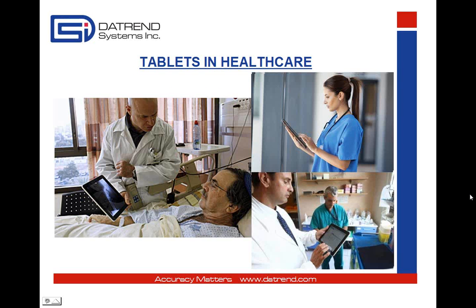Okay, well, let's leave behind the technology of the 90s, and we're going to jump ahead to now. Over the last few years, the use of wireless technology and inexpensive mobile computing devices, and in particular tablets, has expanded greatly in the hospital. There's an obvious benefit to medical imaging, where a tablet can be used to replace film. They're being used by nurses to do the charting, to reduce the errors that you can get with paper records. They're also handy just as an internet device for Googling symptoms, side effects of meds, things like that. To support the increasing use of smartphones and tablets in the hospital, the wireless infrastructure needed to support them has also grown.